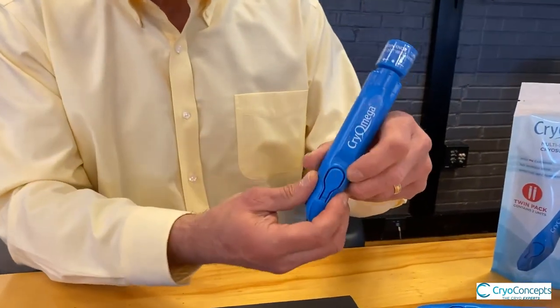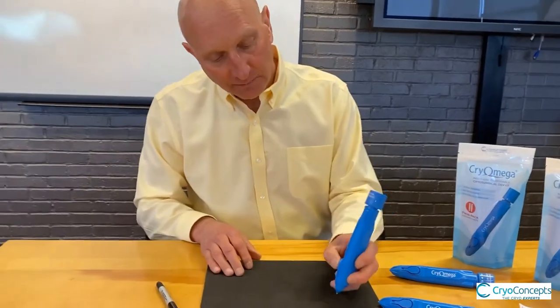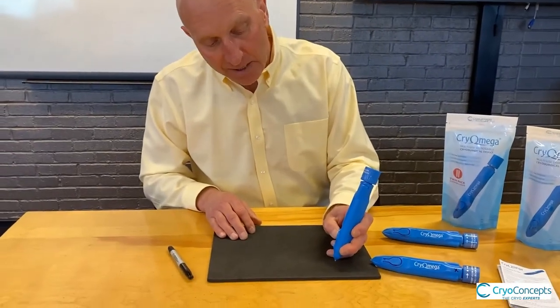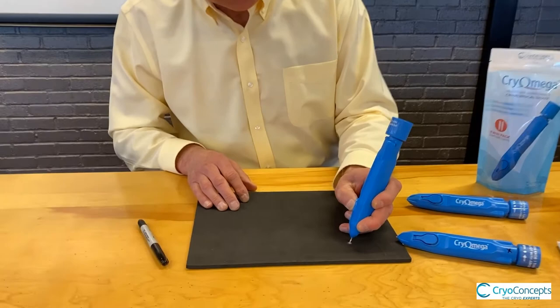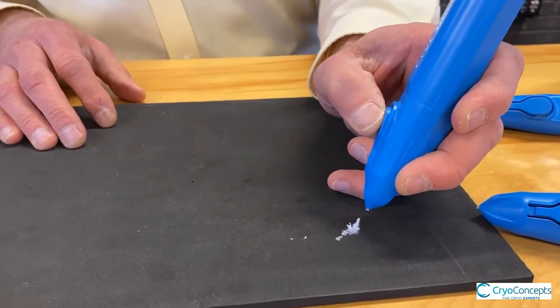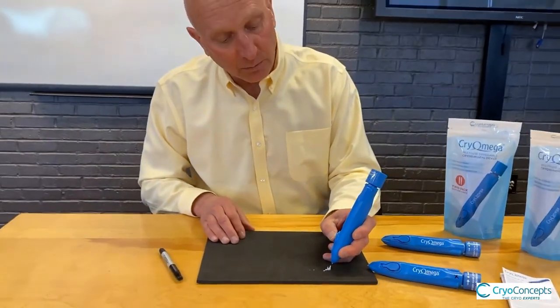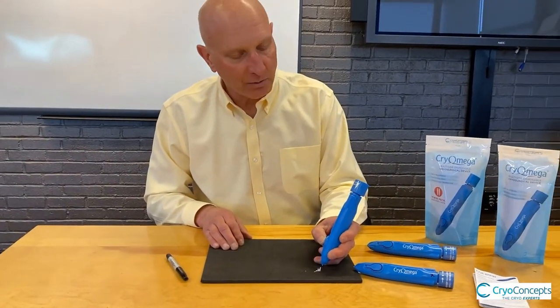You'll notice that it's protected here to keep it from accidentally being turned on. Find your comfort — if it's your thumb, simply put it about a quarter inch from the surface to be treated and press the button. It immediately starts to dispense liquid nitrous oxide.